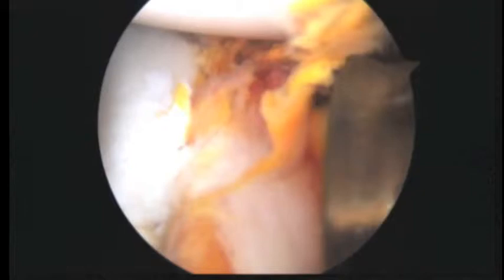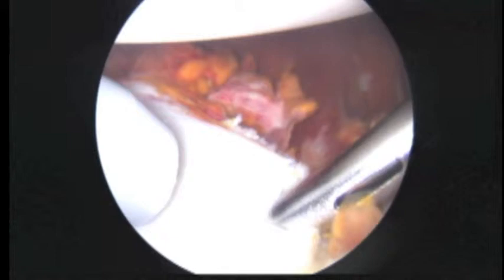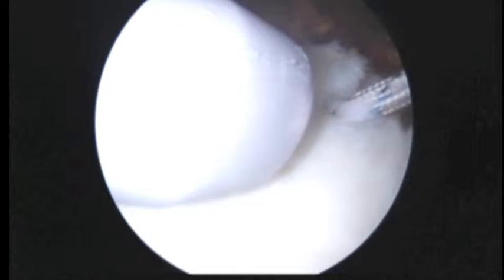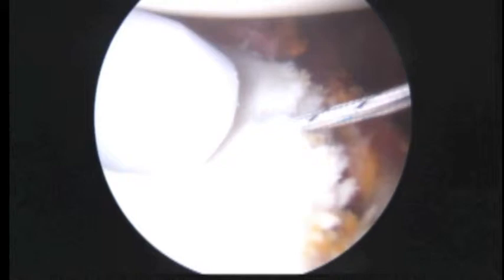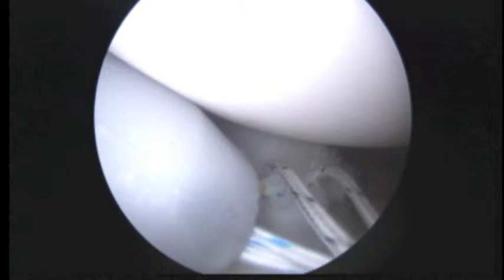We want to get this lifted up so it sits way up here. It's kind of split already, so we have to be careful with it. Through the magic of Hollywood, we're able to show you now — we've got that anchor down, and now it's seated, very solid. You can see some of the damage along the front edge of the socket. But first we're going to go ahead and take out some sutures here — these blue and white ones — and slide those out over a switching stick in the back.